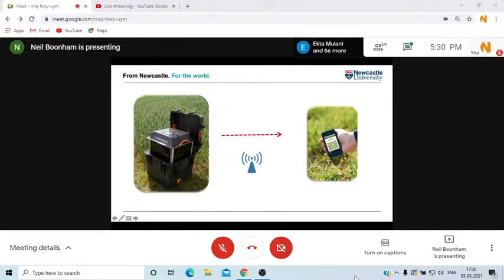So on a daily basis, we collect a spore sample, it goes into the tubes, we do the testing, and that data is then transmitted wirelessly into our smartphone or into some kind of decision support system. So we're getting a measure of the amount of pathogen that is around on a daily basis, and also on which days we're seeing pathogen.